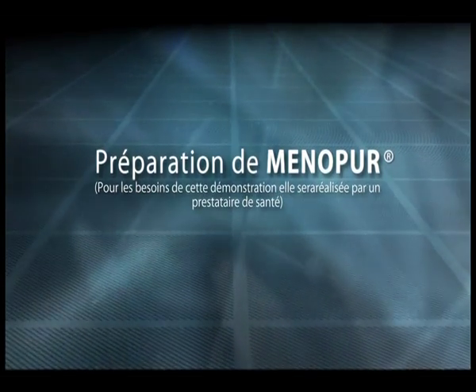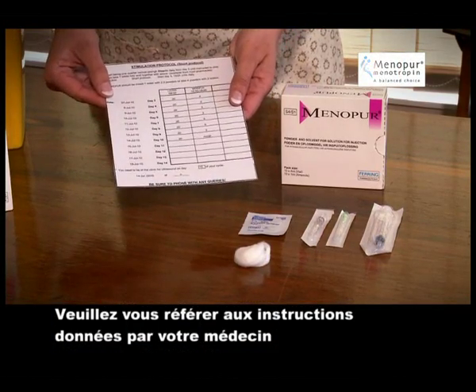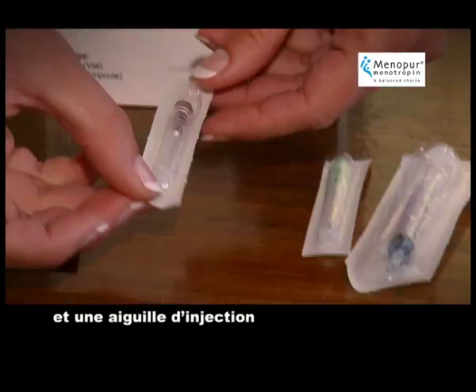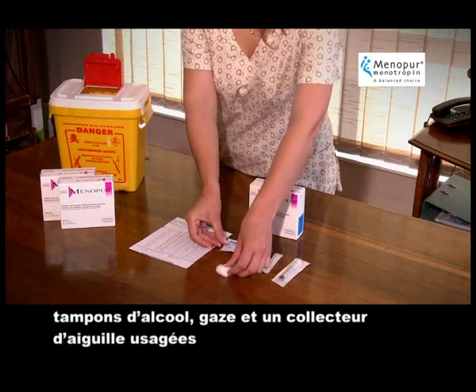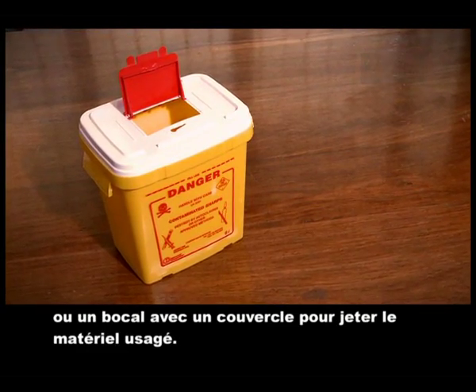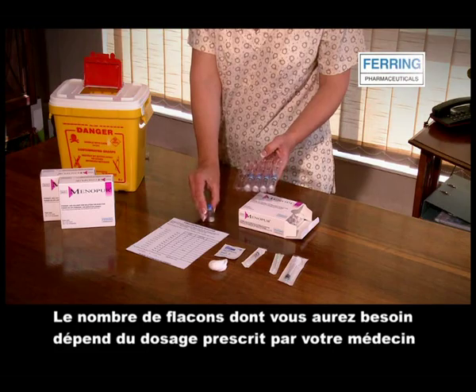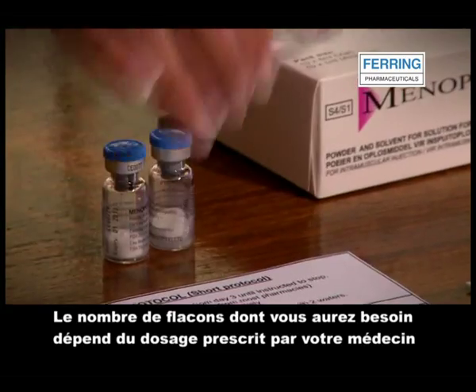Here is what we will need in preparing the Menopur. Please refer to the script your doctor gave you. A sterile syringe, 1 mixing needle, and 1 injecting needle. Alcohol swabs, gauze, and a needle disposal container or a jar with a lid for disposing of used material. 1 or more vials of Menopur in powder form. The number of vials that you will need depends on the dosage your doctor has prescribed.